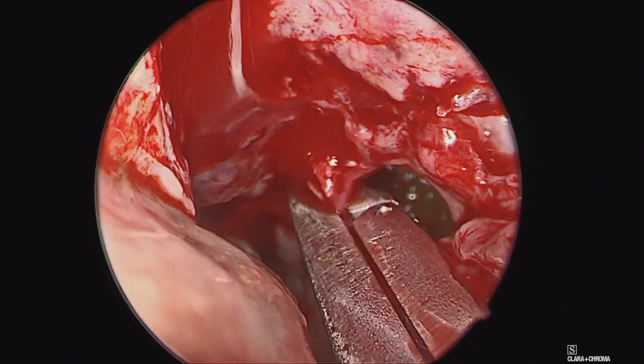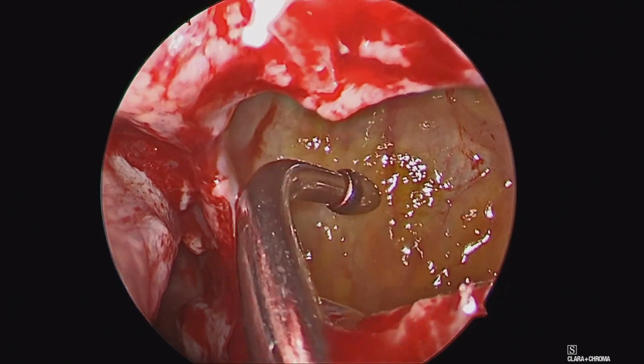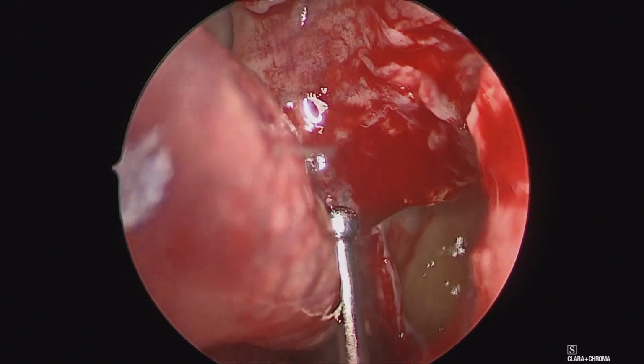The bulk of the tumor is, of course, not in this particular area, but what this allows us to do is to have full access as we dissect posteriorly and allow a thorough working space for our instrumentation.